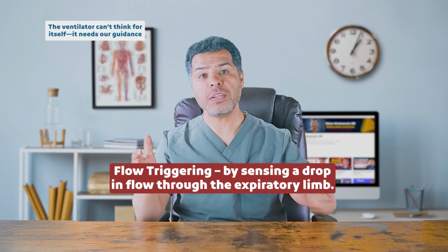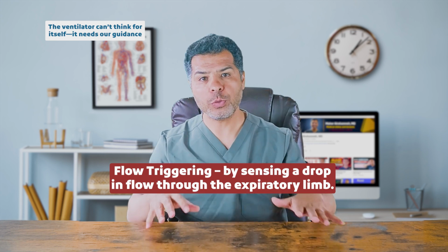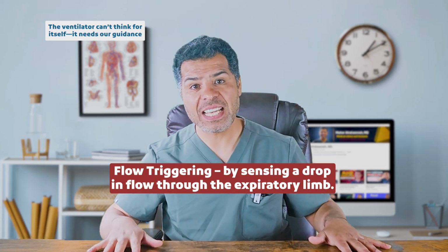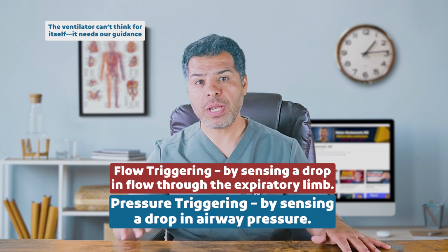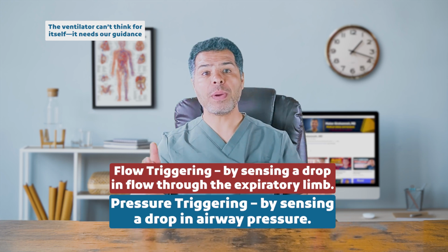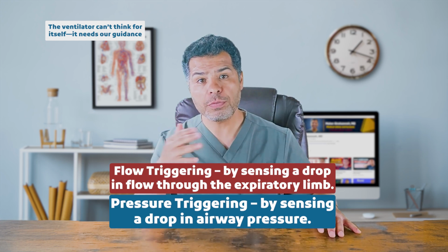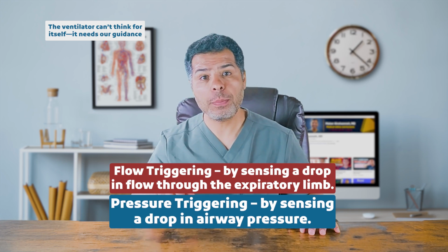Alternatively, the ventilator can detect a drop in airway pressure caused by the patient's inspiratory effort and use that as a trigger. This is called a pressure trigger. To summarize, the ventilator can recognize a patient's attempt to breathe in two ways: flow trigger, by sensing a drop in the flow through the expiratory limb, and pressure trigger, by sensing a drop in airway pressure.